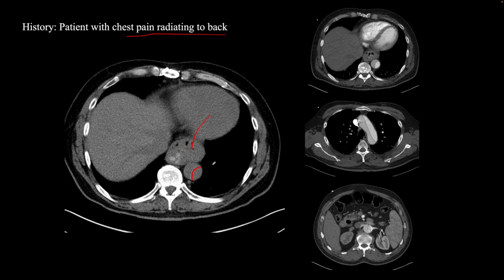And so this was called on this non-contrast study, and we asked them to do a contrast enhanced CT, because doing a contrast enhanced CT to diagnose this aortic dissection has more benefit to the patient compared to the risk of damaging their renal function from the contrast administration. So a contrast enhanced study was performed and an aortic dissection was correctly reported.